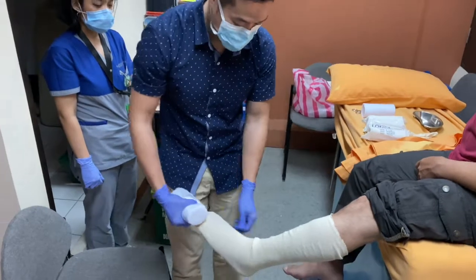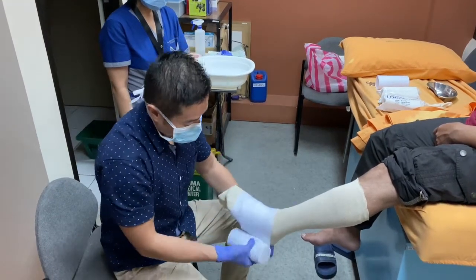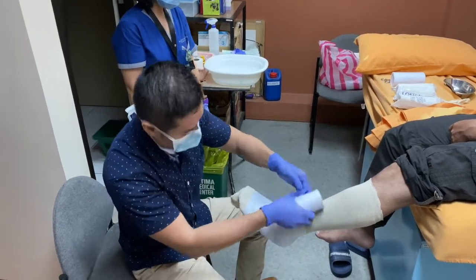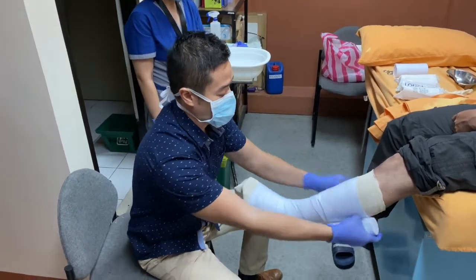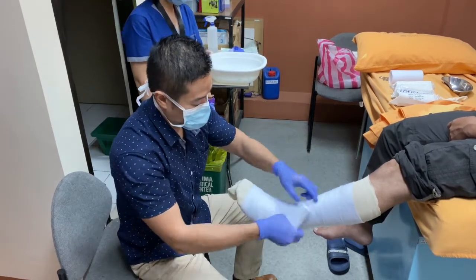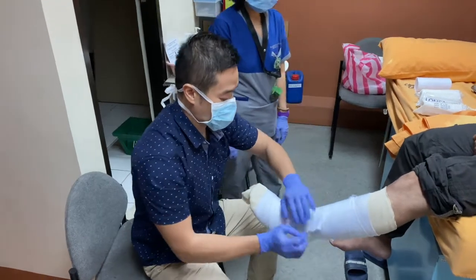Now we use the wadding sheet as the padding. We should have adequate padding for our casting to prevent any pressure sores. Apply it with 50% overlap, up to the level of the edge of the cast — ideally around two to three layers only. You don't want too much padding because this will make the cast loose and defeat the purpose of immobilization.